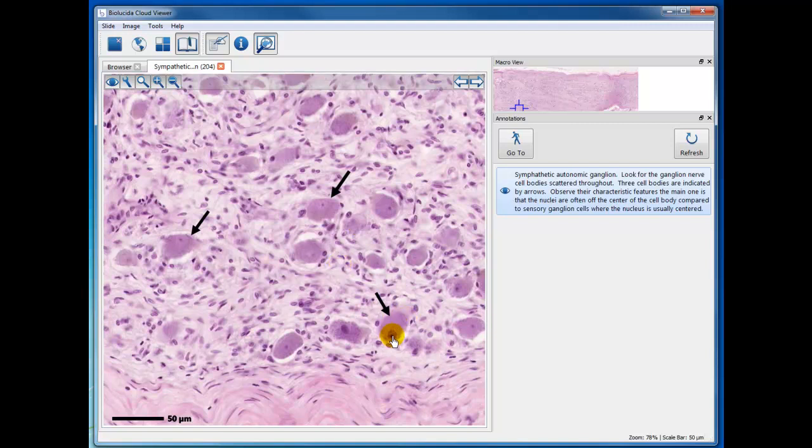But the nucleus is often located off to one side of the cell. That's one way. We're really not holding you responsible for that. We just want you to recognize when you see a neuron cell body, and also whether it's a motor neuron from the spinal cord or, say, in the brain, the pyramidal cells, and you'll see that in the lectures and the lab.